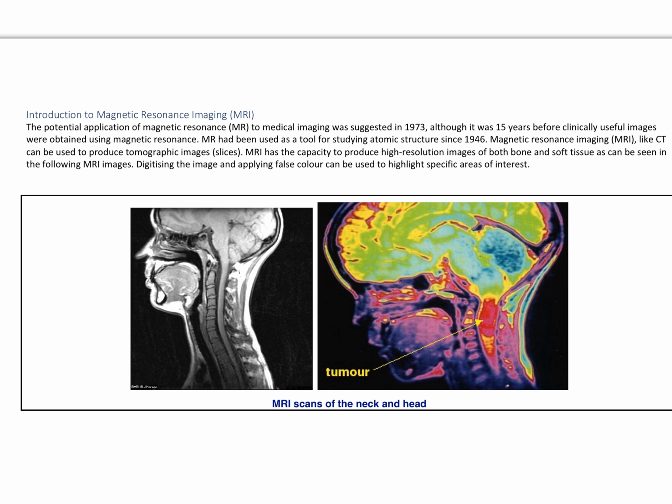Magnetic resonance imaging, or MRI, uses very strong magnetic fields and radio frequencies to have an effect on the particles within the human body. Those particles include protons and neutrons within each atom. Now, not every atom is affected in an MRI scan, and we'll see why that is. The technology has been around or investigated since the mid to late 1940s.